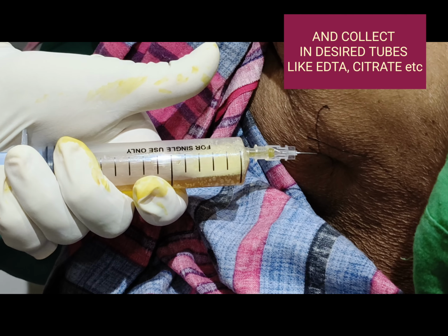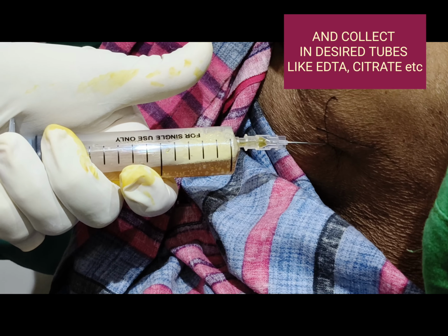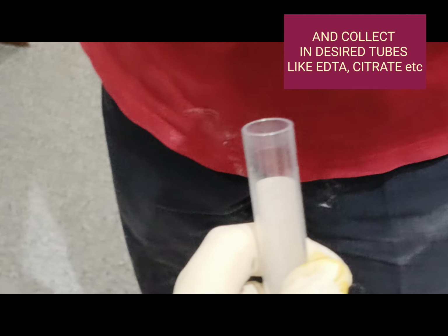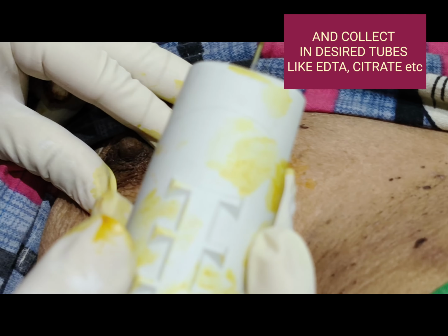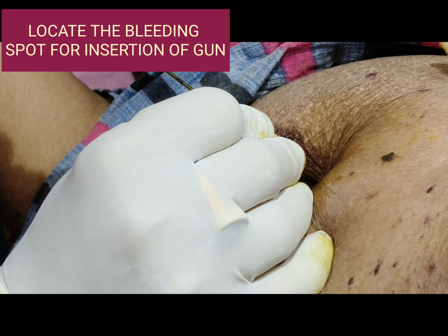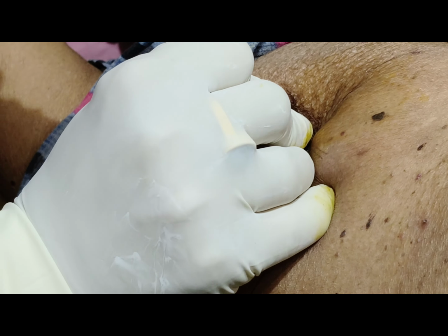Doing biopsy, collection of the tissue will be easy. After collection of the fluid, close that area with skin adhesive, and now we are starting with the biopsy.